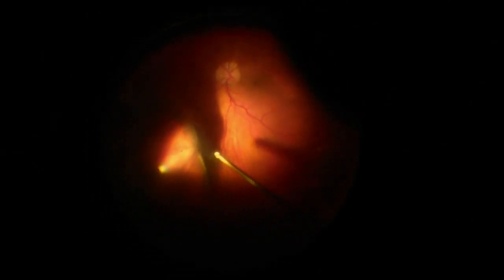Now, we are completing our vitrectomy under indentation. The most important aspect of any retinal detachment is to properly identify the vitreous base and shave it down as much as possible to limit the risk of postoperative retraction and redetachment. In this case, we observed multiple lattice degenerations. We must be meticulous in our surgical approach, shaving as much as possible under indentation while carefully visualizing the small holes in the lattices. If we have any doubt, we generally perform laser treatment around the lattices.